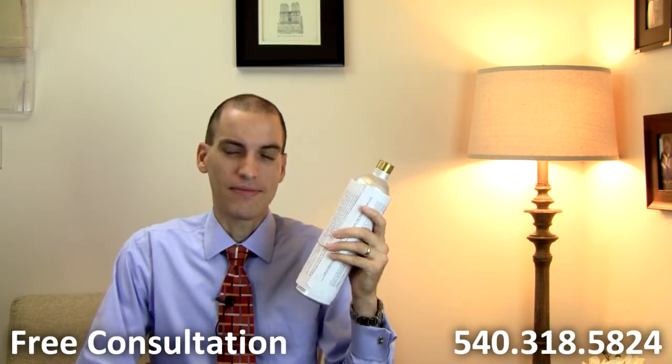In this video we're going to continue our talk about the preliminary breath test and look at the dry gas cylinder. What is this thing and why does it even matter? Well, the dry gas cylinder matters for the preliminary breath test and also for the actual INTOX ECIR2. All these machines use the dry gas cylinder to do the calibration test to make sure that the machine is reading the proper level of alcohol in the sample that the machines are given.